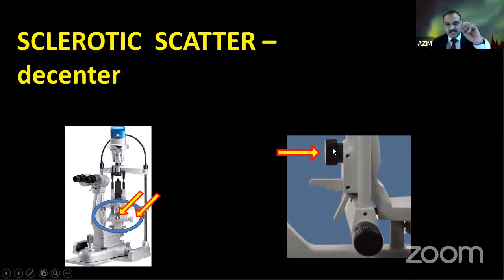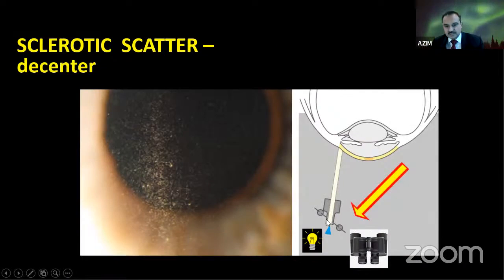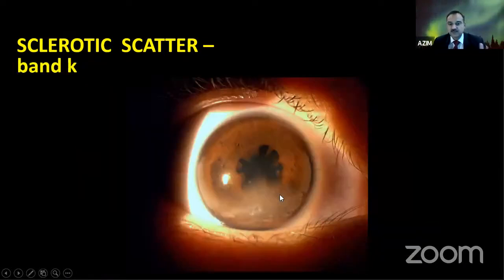This knob, you decouple the knob, and then the axis tilts. You see here, this is not at right angle. This is tilted away. This is what you look for. How does it look? I'll give you an example.